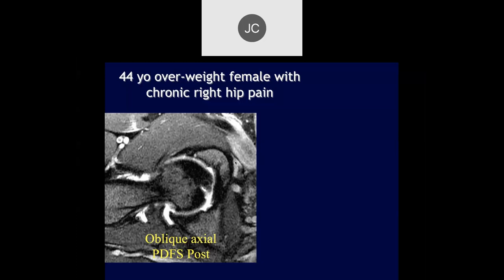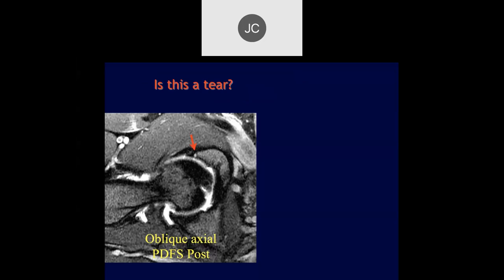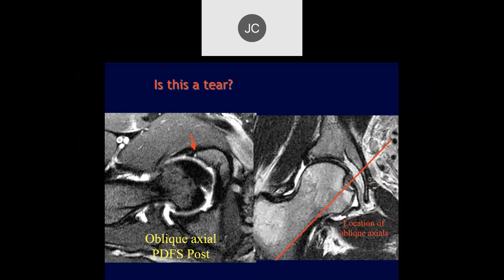Danny, what do you think of this case — 44-year-old overweight female with chronic right hip pain? Let's concentrate on the labrum. We see a little fluid here between the labrum and the bone, really at the chondrolabral junction. The question is: is this a tear? In this particular image from the oblique axial views, this is very far anterior.